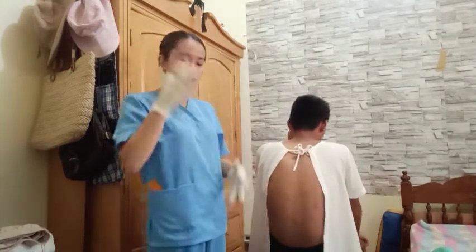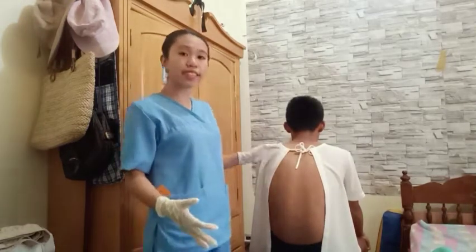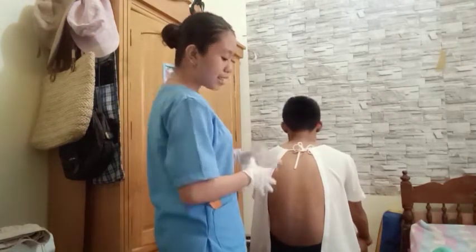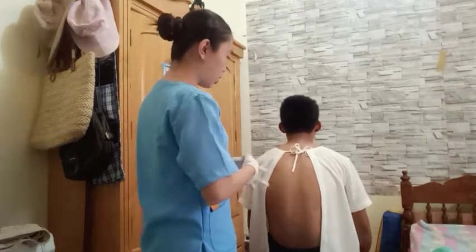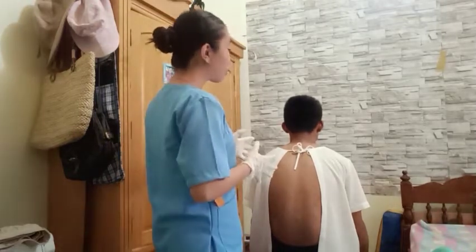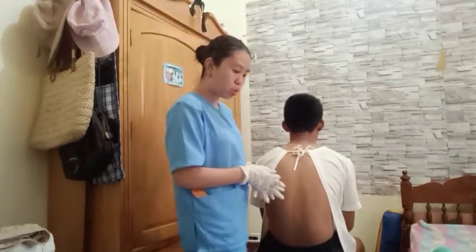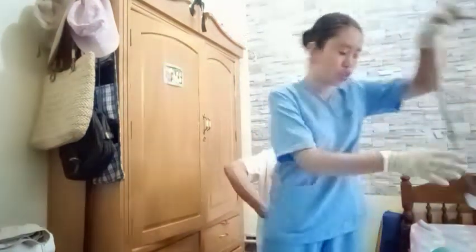Again. So now auscultate for the breath sounds, noting location, and also auscultate for the adventitious sounds and the voice sounds. So for the bronchophony, ask the client to repeat the phrase 99 while auscultating the chest wall. Okay. So for the egophony, ask the client to repeat the letter E while listening over the chest. Okay. So I will be using this stethoscope to hear the vibration.